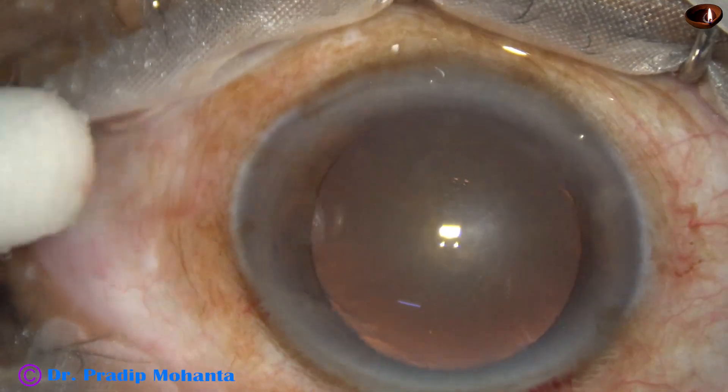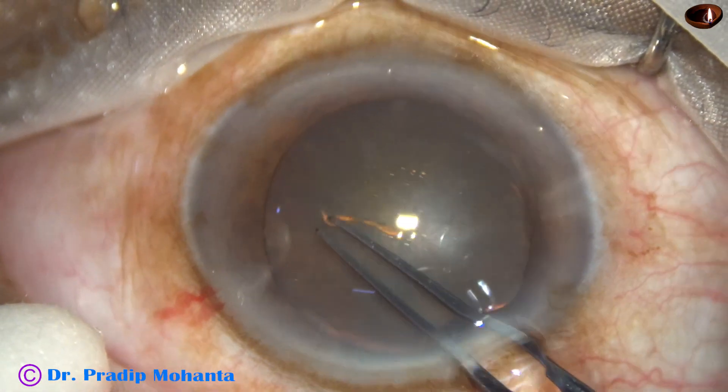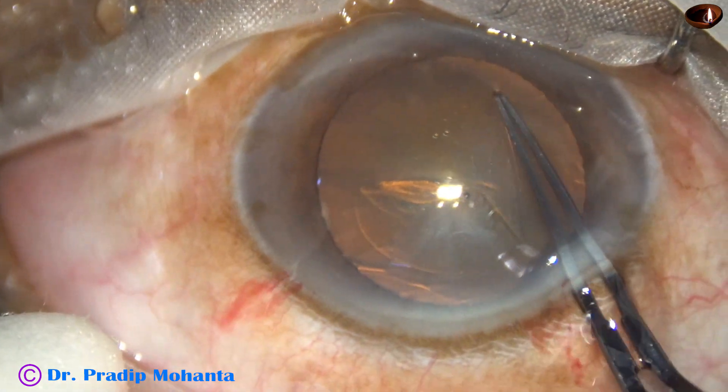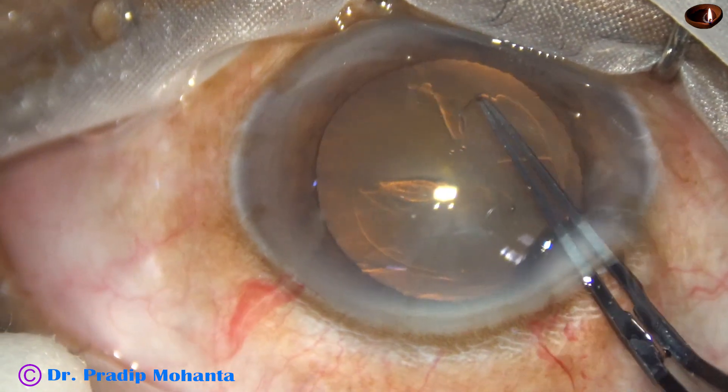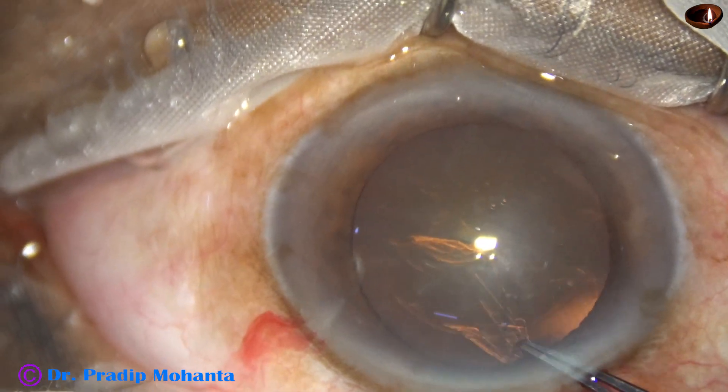Capsulorhexis is done with the help of utrata forceps. The size of this rhexis is about 5.5 millimeters.